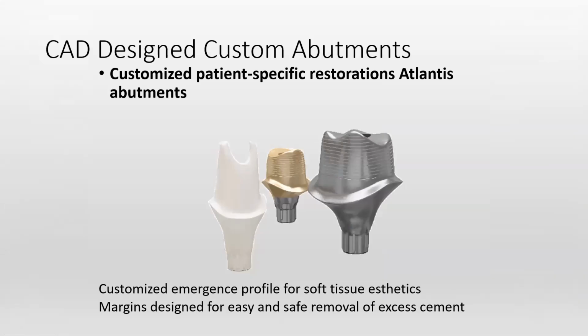Moving on to the CAD designs, computer aided design for prosthetic rehabilitation. We have these customized abutments which can be designed on the ExoCAD. Basically, these customized abutments give good emergence profile for the soft tissue aesthetics, and the margins are designed for easy and safe removal of excess cement here.